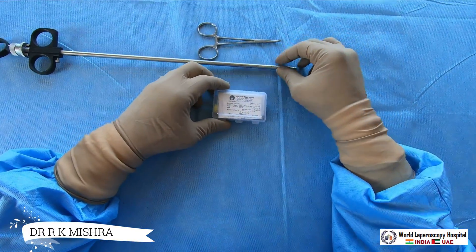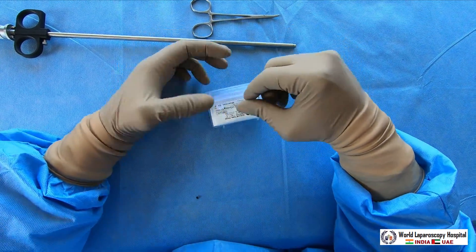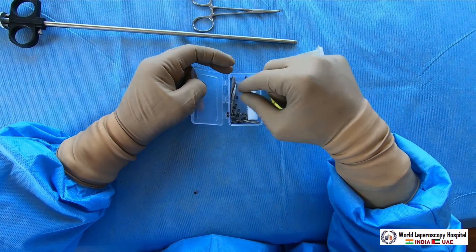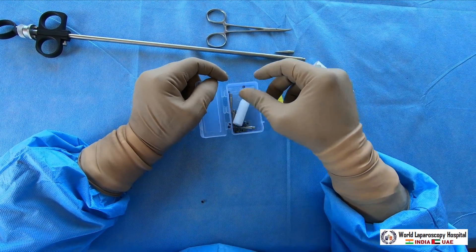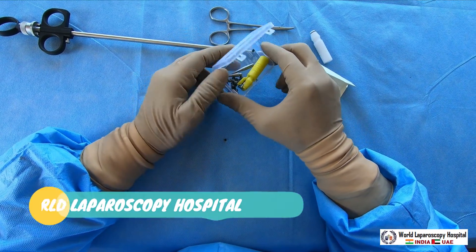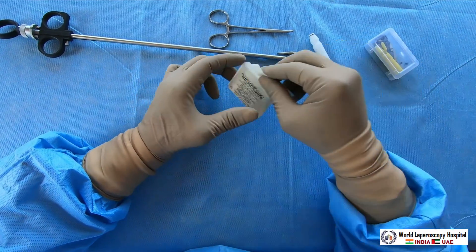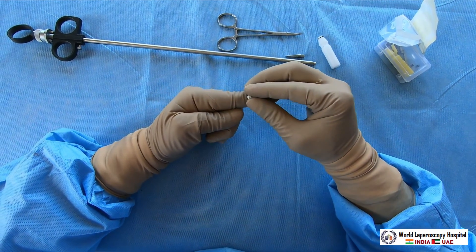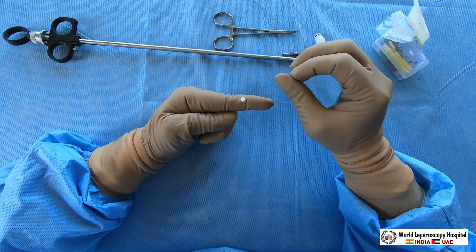Now I will show you the ring and ring cone, and how to load it. Here we are unboxing — this is the fallop ring and this is called the ring cone. Ring cones are available in metal as well as plastic. These are the different ring pushers — you use one of them to apply it. The fallop ring is made of silicone, is white colored, and has very good elasticity.